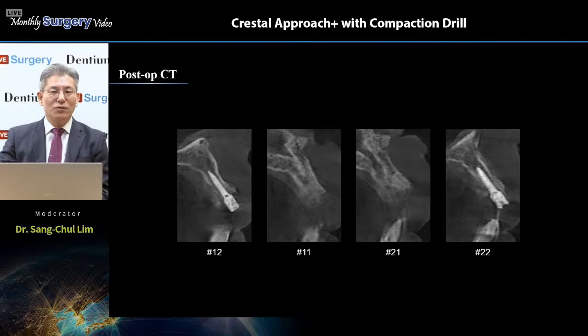And the CBCT view shows us the correct and precise insertion of this implant system, the Bright TL, in the socket area. The extraction and immediate implantation case, actually 12 and 22, shows precise insertion at exactly the correct and ideal point between both cortical plates, buccal and palatal, and engaged cancellous bone, very nicely engaged with the implant surface, as you can see.